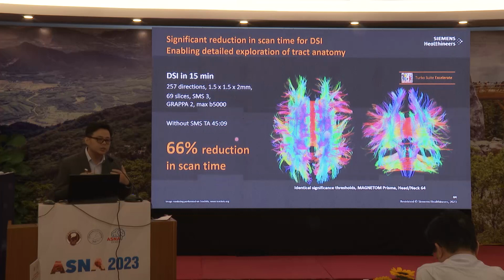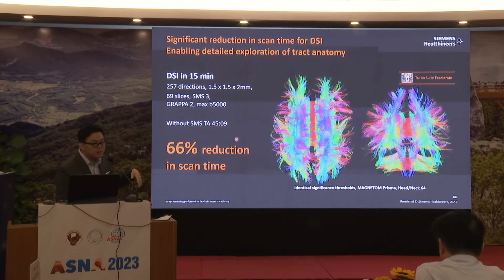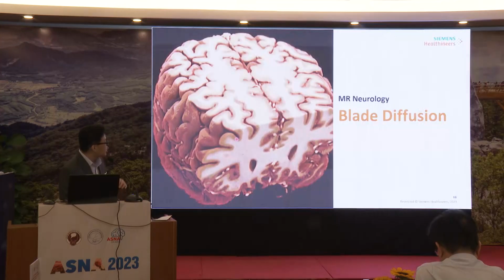Basically, DTI is just one way of representing the diffusion, the so-called eigenvector. As long as you have more than 6 diffusion directions, you're able to map out the water molecule eigenvector directions. However, DTI is just one way to represent that information. Whenever the brain white matter has the crossing fiber issue, the DTI way of representation is not able to cope.